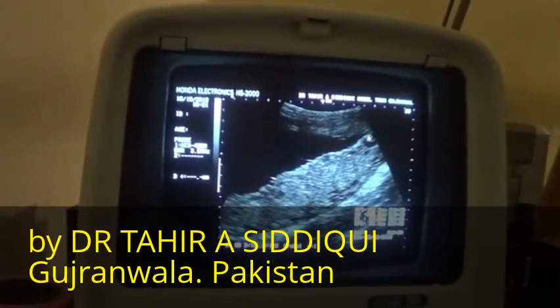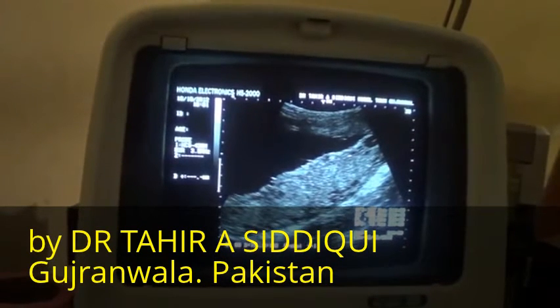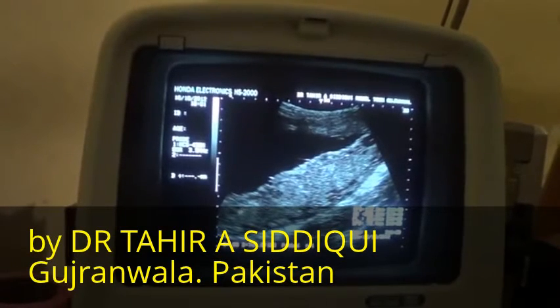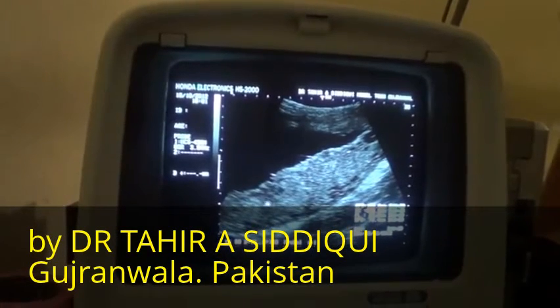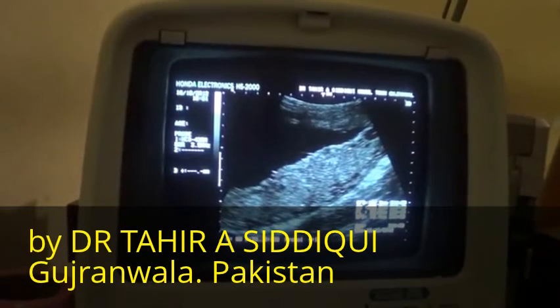These are the placental lakes, and these are the echogenicities along the chorionic plate. This is the placental substance. There is no calcification in it, and in this region we see no calcification.